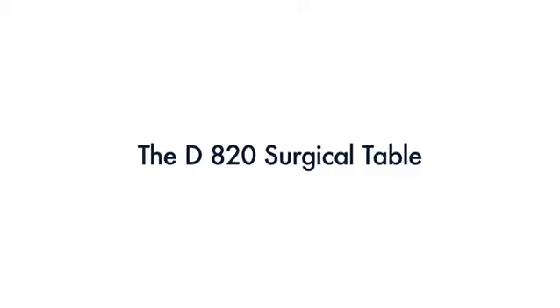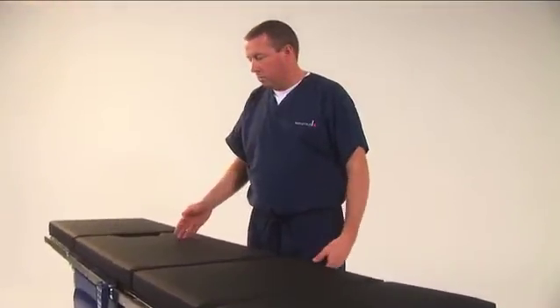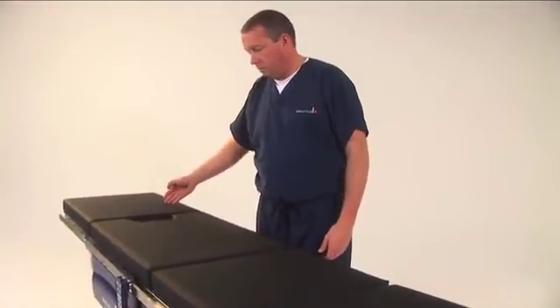The D820 Surgical Table includes a detachable head section, a detachable back section, the seat section, and a detachable leg section.